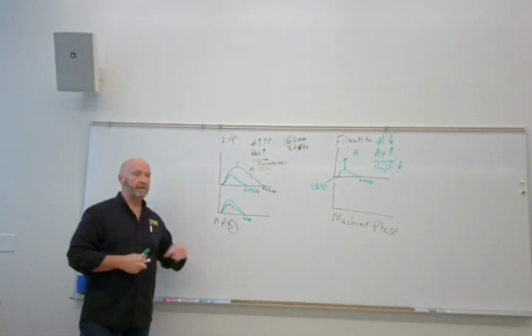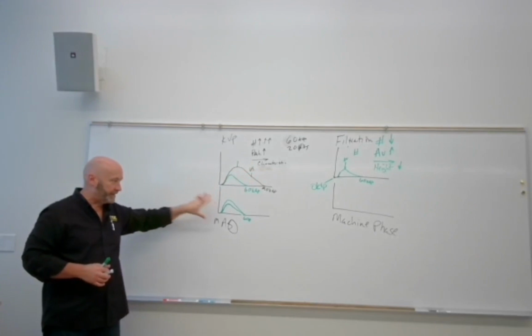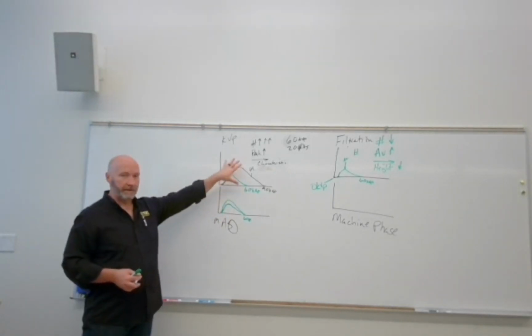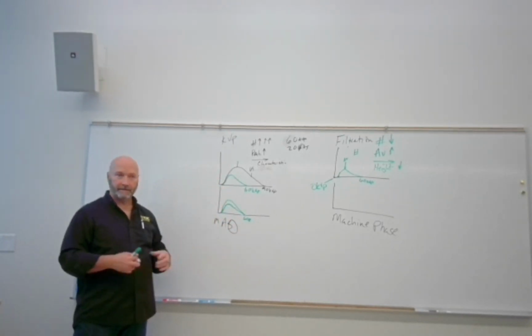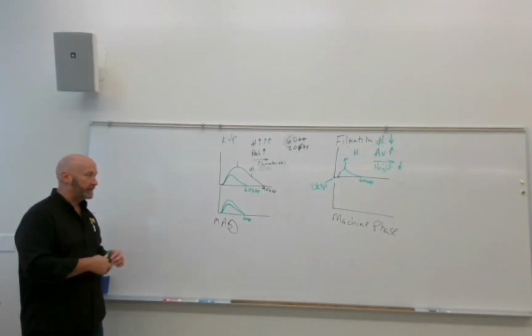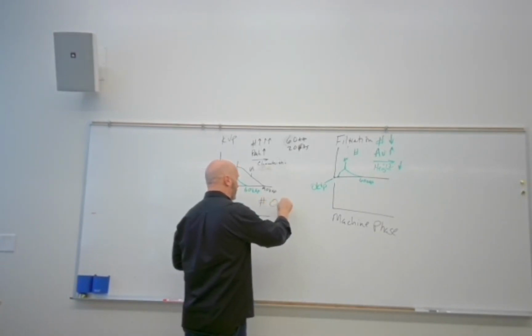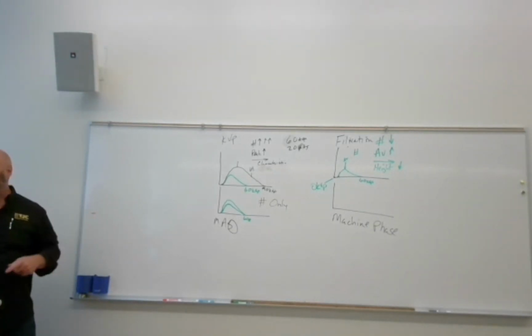Because mA increased just numbers and nothing else, and kVp changed all this other stuff, mA became the adjustment factor of choice, and it still is in most cases. Because you don't change the imaging characteristic of your X-ray beam in any way, this is what has historically been the factor of choice. Again, I expect that to change some. So, numbers only.